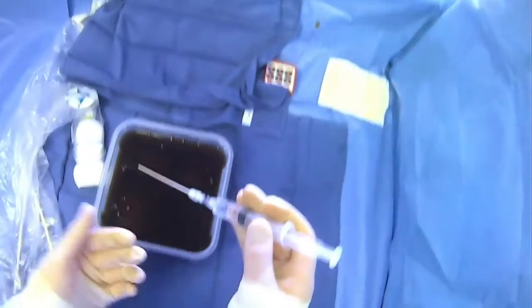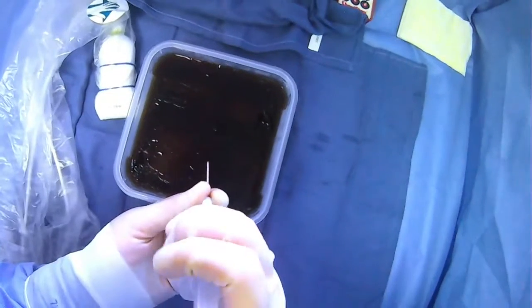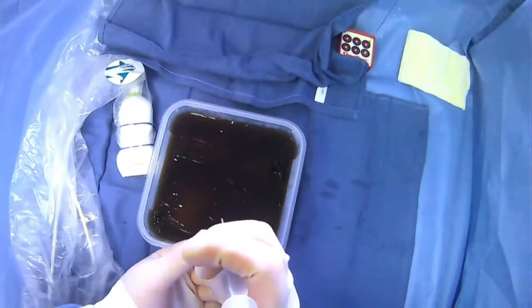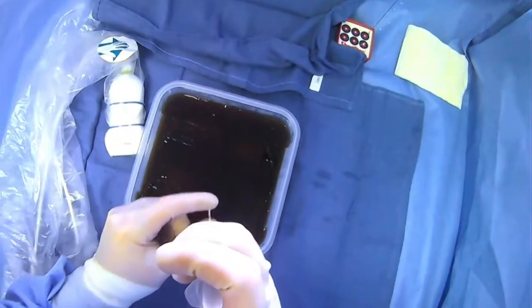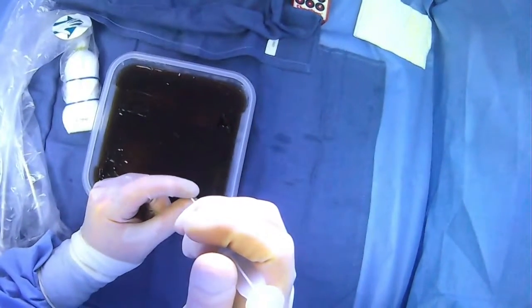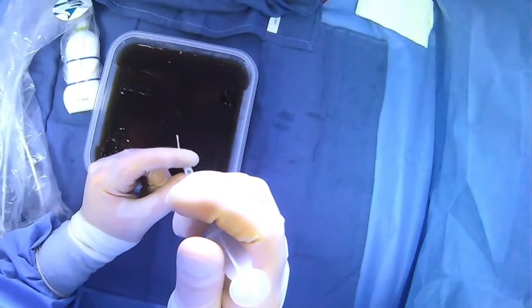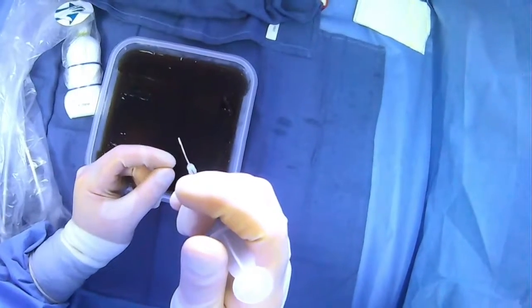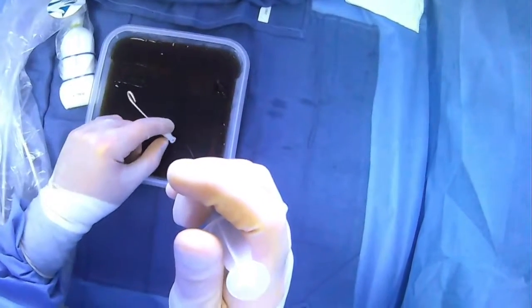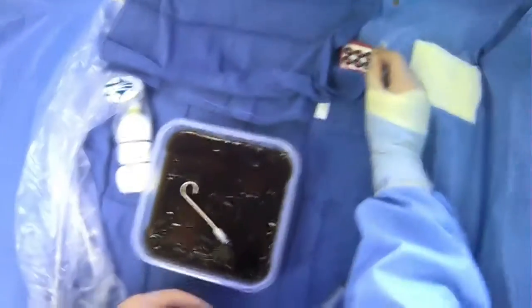You're going to have to do whatever is comfortable and works in your hands. Ultimately, keep advancing: give lidocaine, aspirate, give lidocaine, aspirate. Once you actually aspirate back ascites, hold everything very still and just feed off the catheter without moving the needle — like so. That's what's so advantageous about having the other hand free from ultrasound: you can feed off the catheter without having to worry about handling the probe.